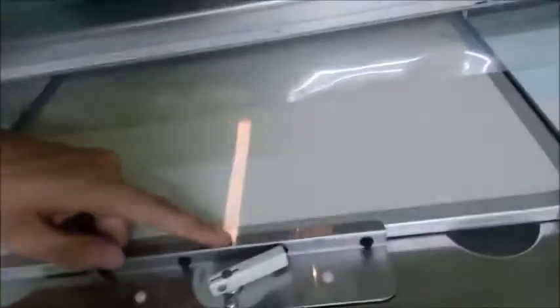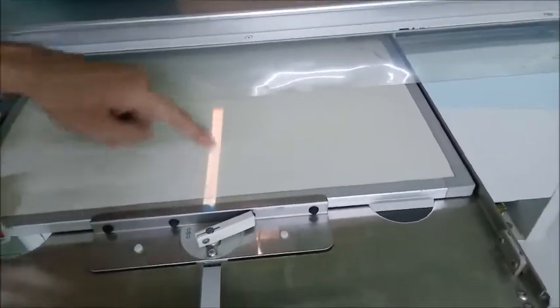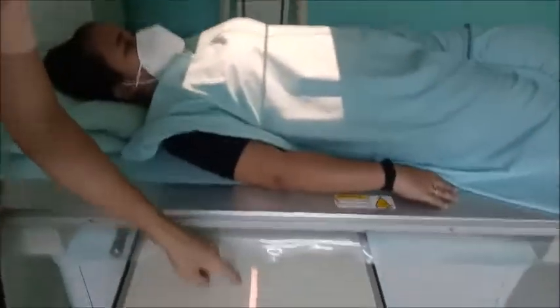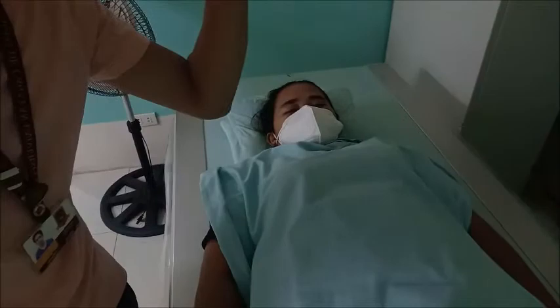So the center kabantay man medyo na triangle gamay dire. Yeah, that's the center of the 14/17. So that means ang center sa atong tube is at the center sa atong IR. And then kani siya, yung vertical nga line is at the center gihapon dito sa atong IR pagpasulak nato.